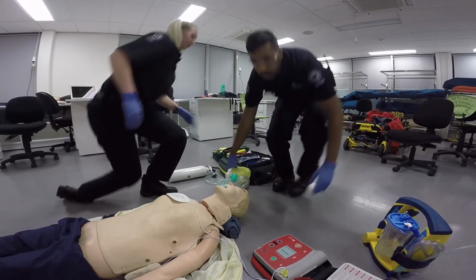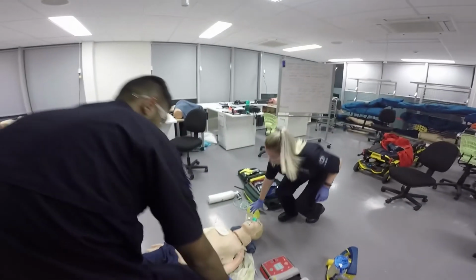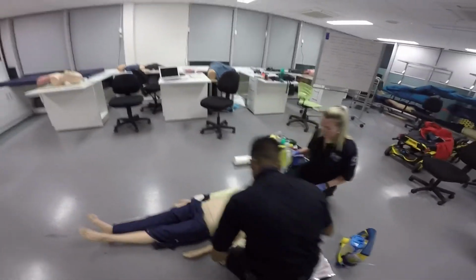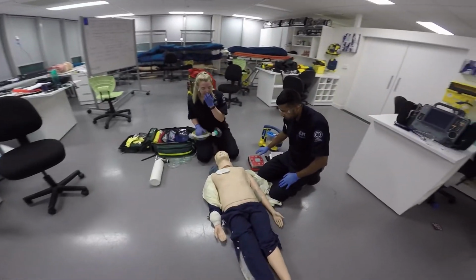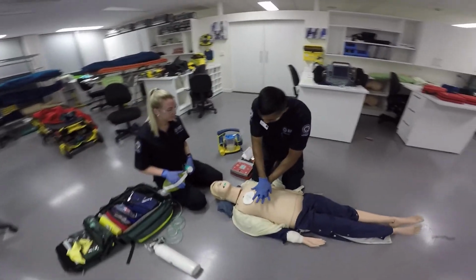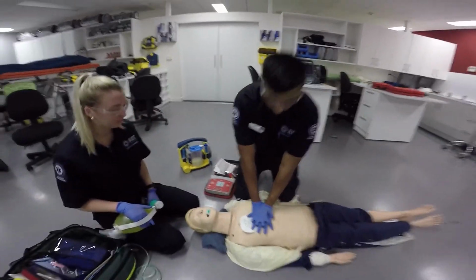We'll stop to the left. Analyzing heart rhythm. Stay clear. All clear? Analyzing heart rhythm. No shock advised. Alright, so I'll go back to compressions. If needed, start CPR. Right.